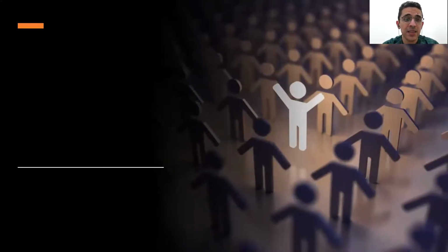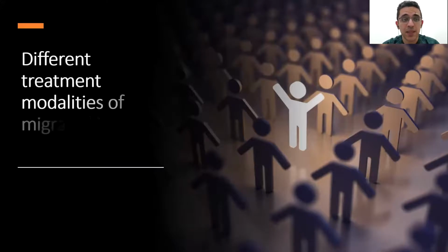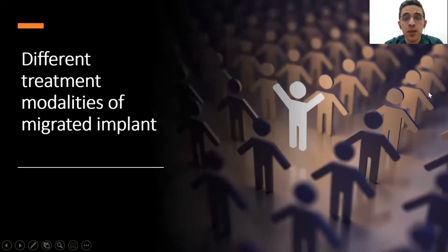يعني في أحيان كتير جدا بيبقى عندنا asymptomatic patients وبيكون البيشنت ده asymptomatic. The patient doesn't complain of anything, okay, but he has a displaced implant inside the maxillary sinus.